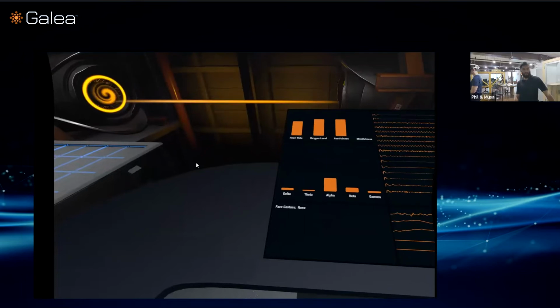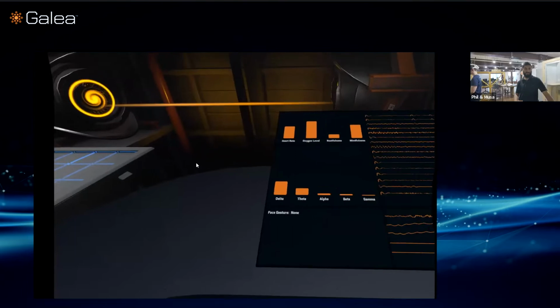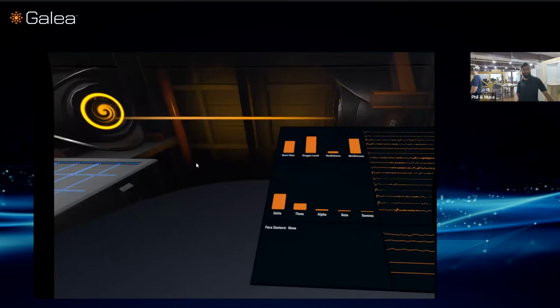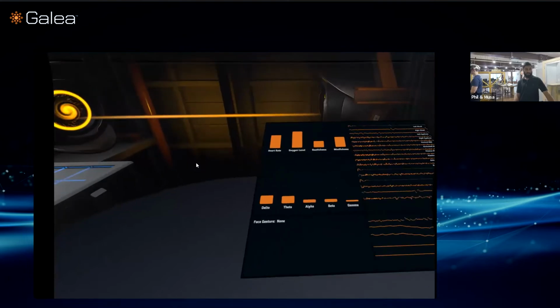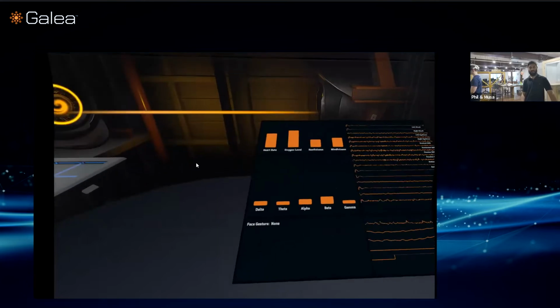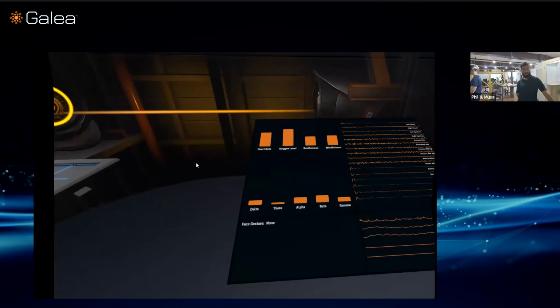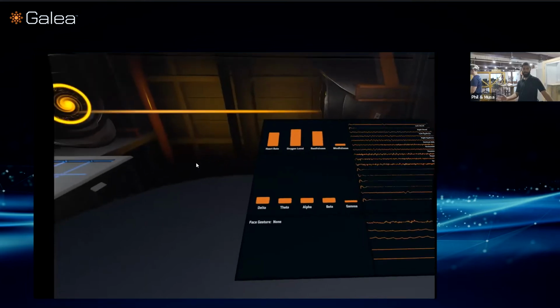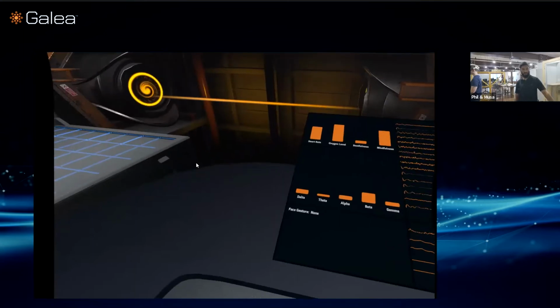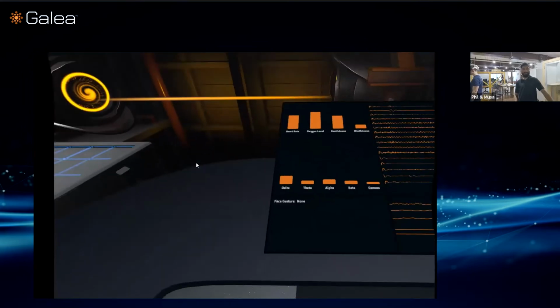So this is where you use a Fourier transform in order to separate out the frequency components of your raw EEG data, and you can put them into bins like delta, theta, alpha, beta, and gamma. Your delta is the very low frequencies up to 4 hertz, theta is between 4 and 8 hertz, alpha is 8 to 12 hertz, beta is between 12 and 30, and gamma is 30 and above. This gives you some very broad ranges of frequencies where you can judge what kind of mental activity is going on in a broad spatial range.